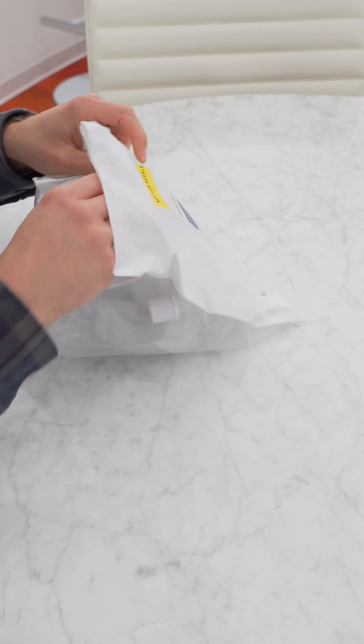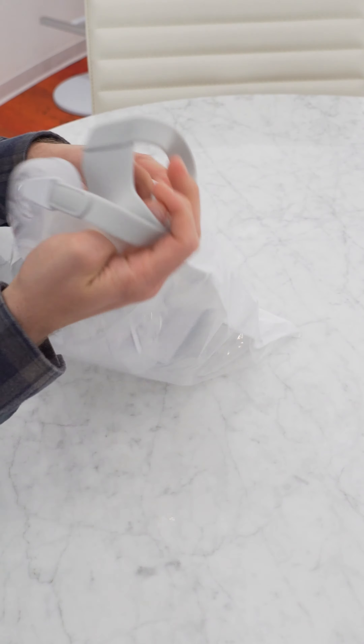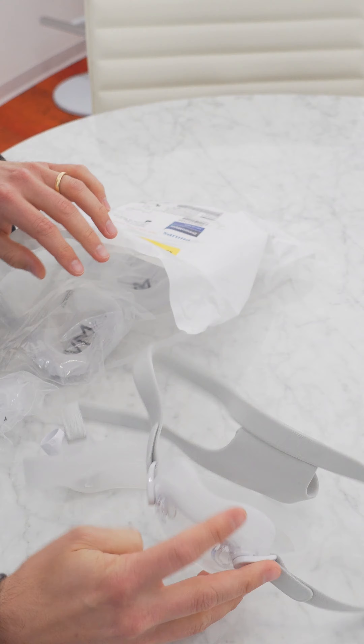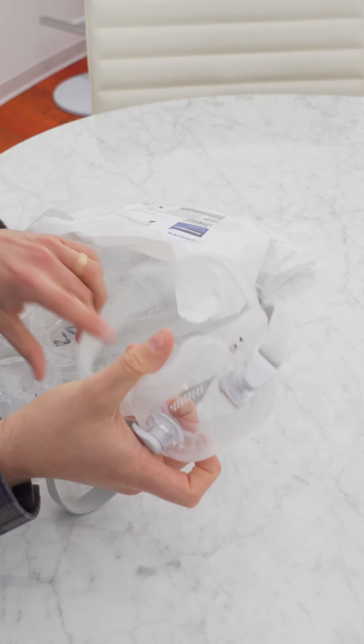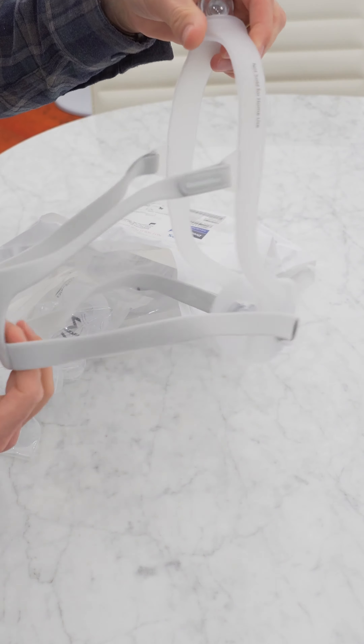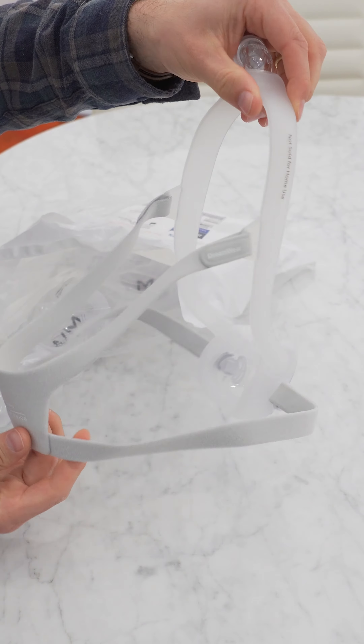Let's unbox the Dreamwear Full Mask. Inside, we're going to have a few things. We're going to have your mask fully set up already with the small cushion on there. As you can see, pretty standard mask setup.